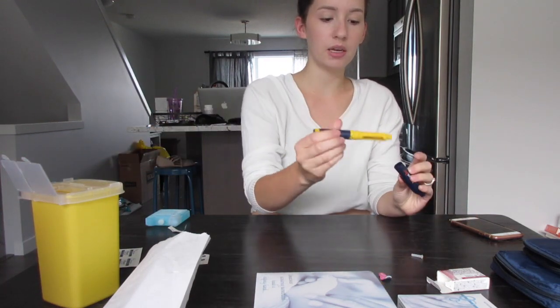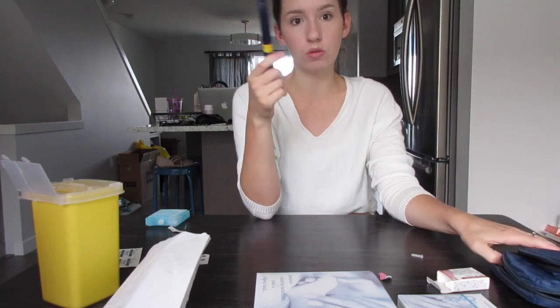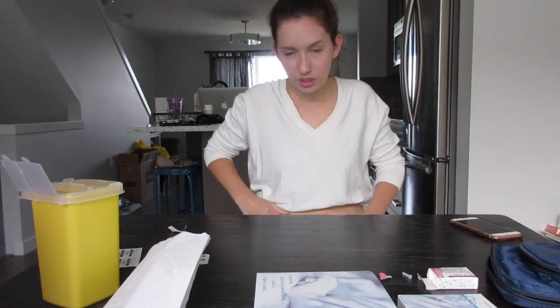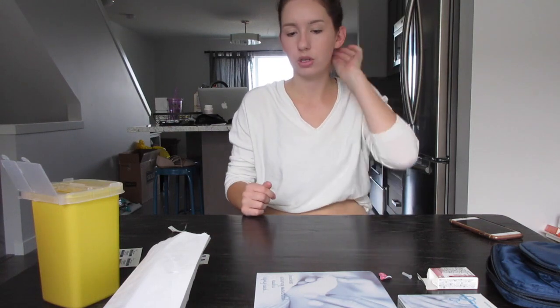Now, this pen is good to put back, and this pen gets reused over and over, which is great. You're not wasting any plastic. Always double check, make sure you're not bleeding too much, then you can just apply some pressure.